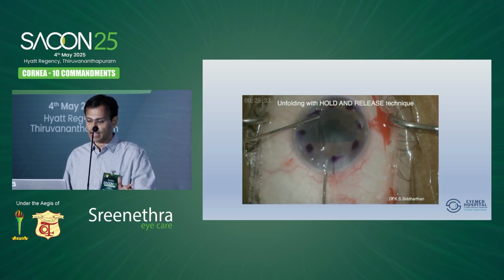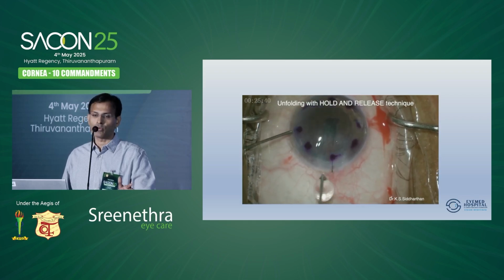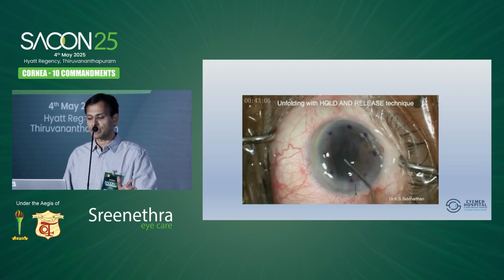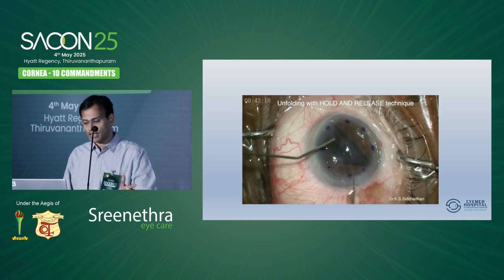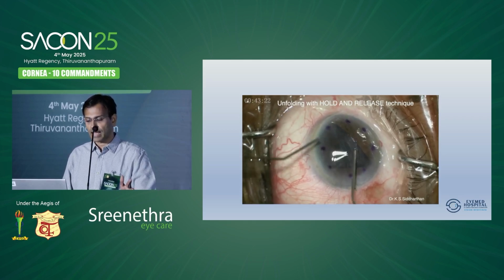Hold it on that side and then inject saline. Try to open it. Yeah, inject saline, tap it. Yeah, it opens. So you don't need to manipulate it too much. Sometimes what happens is when we try to do it, it doesn't open, and there are cases when it takes some time. When you have younger tissue, sometimes it happens like that.